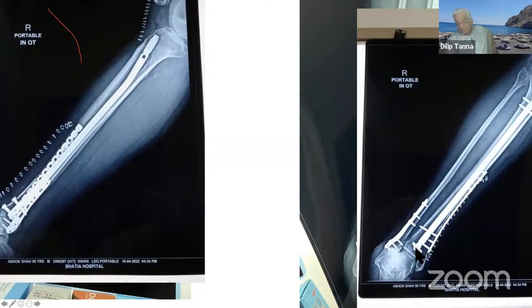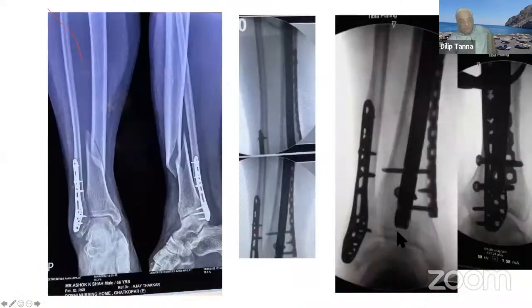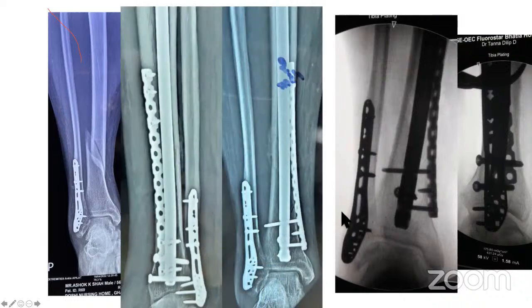Perfect healing is there. Central nail, 3 screws and everything. I added up this plate. Whether needed or not needed, I'm not sure. This is what it was. Added up the plate. This is how we use.